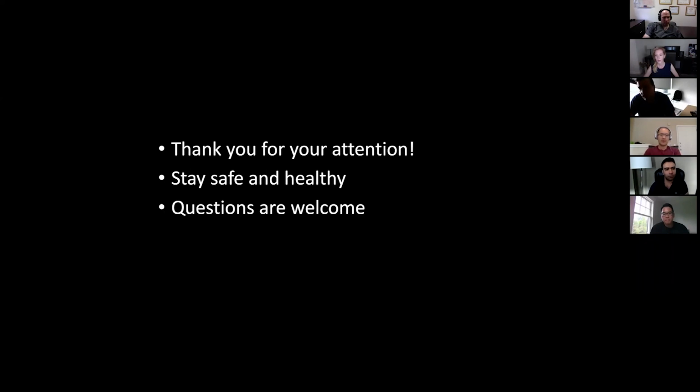I did have a talk with our neurosurgery and orthopedic colleagues about whether I should use the Spine Jack. First up, I only use it in patients with moderate to severe compression fractures. There is no use of Spine Jack in mildly compressed vertebral bodies, because the real use of Spine Jack is to restore vertebral height.